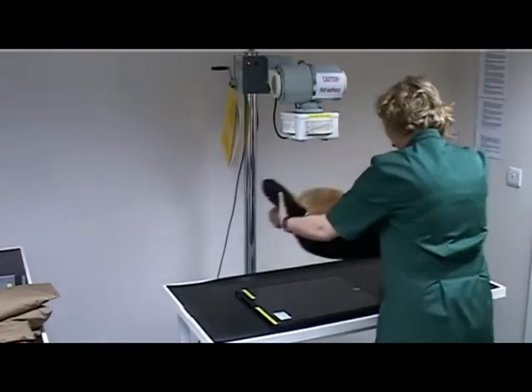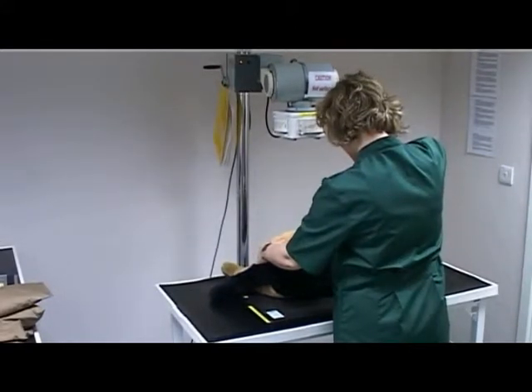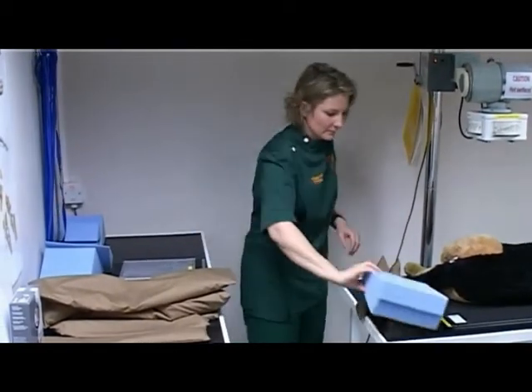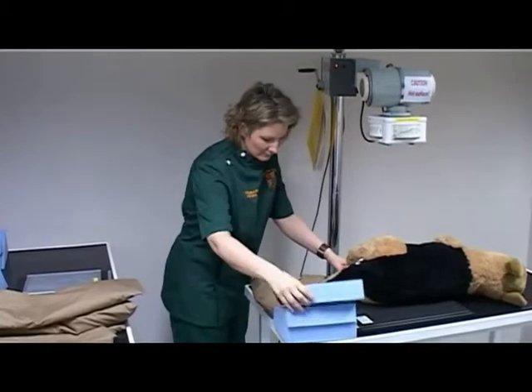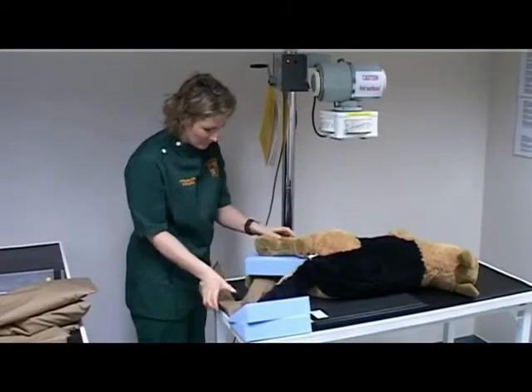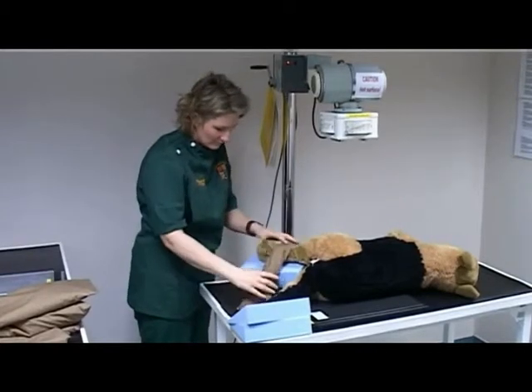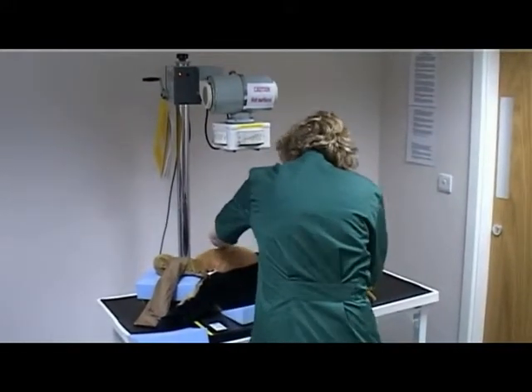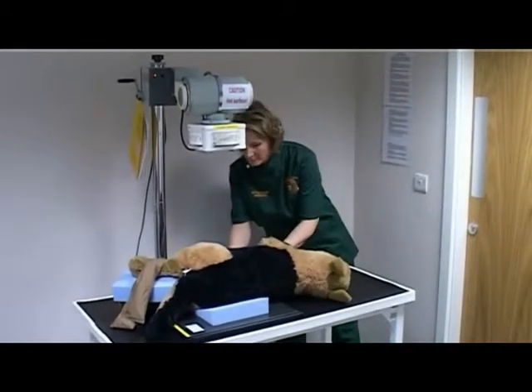Place the patient in lateral recumbency with the lumbar spine region positioned on the cassette. Select the positioning equipment. Draw the hind limbs caudally and place a small foam wedge between the stifles to ensure that the median plane of the body is parallel to the cassette. Secure each hind limb with a sandbag or tie. Place a small foam wedge under the mid-lumbar spine to prevent sagging, and a small foam wedge under the sternum to ensure the median plane of the body is parallel to the cassette.